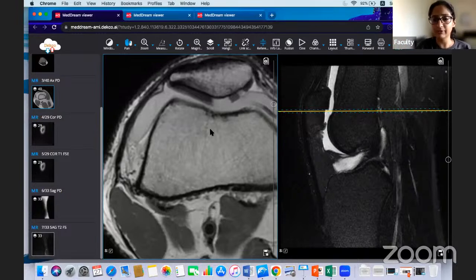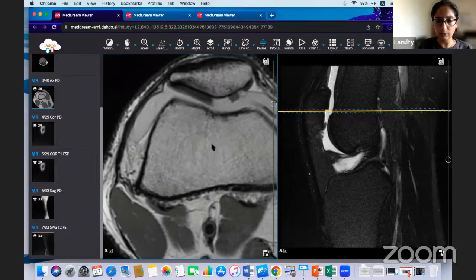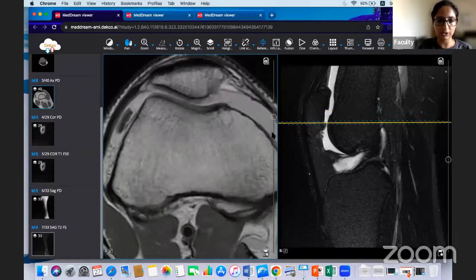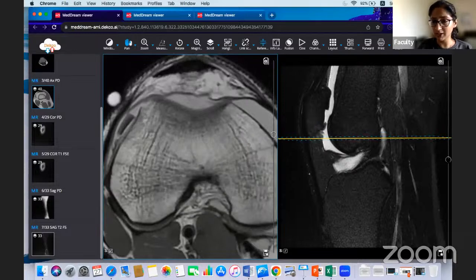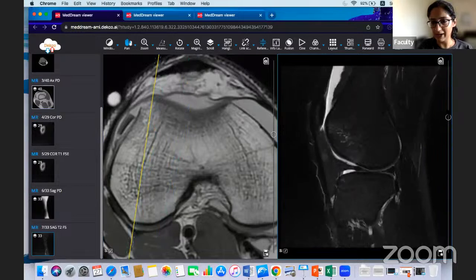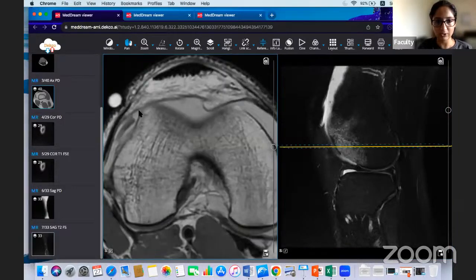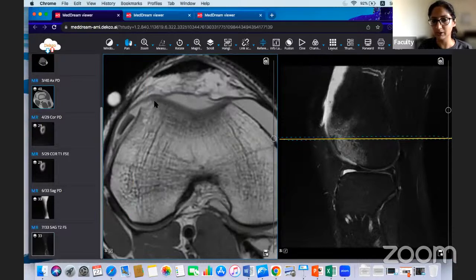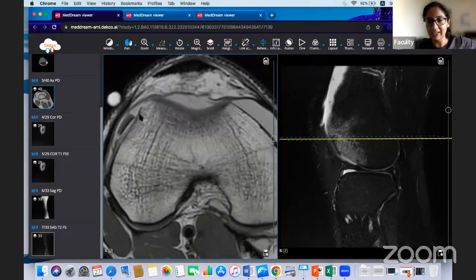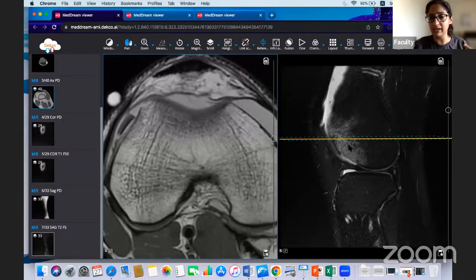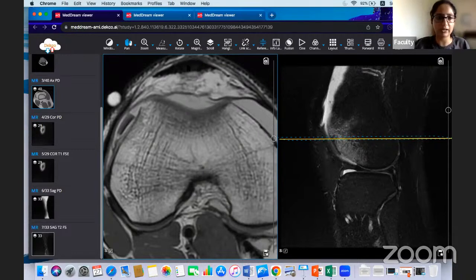Subchondral marrow edema is important — it gives you a clue to go back and look at the articular cartilage. In this case, the marrow edema pointed to a chondral defect that might otherwise have been missed at a curved surface. Always look for loose bodies when you see chondral or osteochondral defects. Marrow edema is a reliable prompt to revisit articular cartilage evaluation.